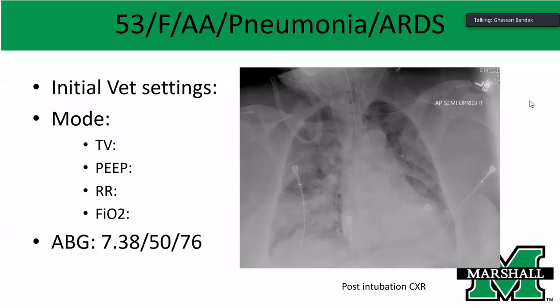You can, yes. So you're talking about asymmetric ARDS. If it's not diffuse and symmetrical, yes, you may need to, and I don't know the answer to that, you may need to change your strategy. But if you look at the patient, she is morbidly obese. The X-ray cannot even show the sides, the armpits of the patient, right?